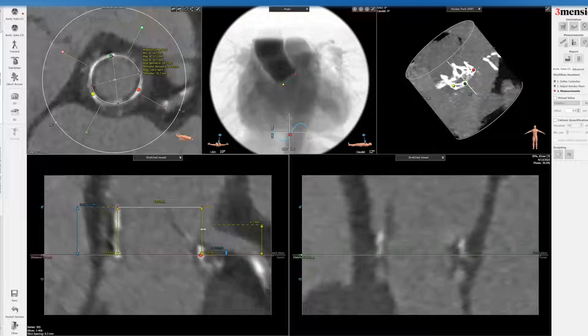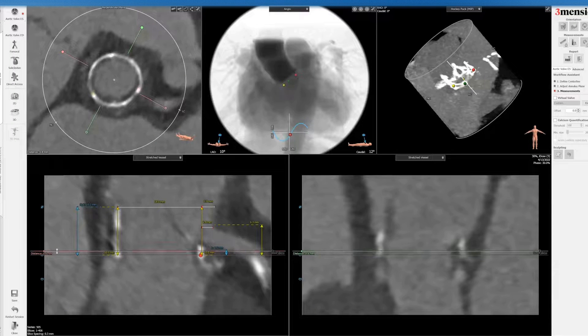Now let's measure the virtual valve to STJ distance because the coronary is so low. You go from this point here to here — that's the distance to supply the coronary. You also want to make sure to see how much flow is present at the top of the valve. We'll fine-tune that in a moment.